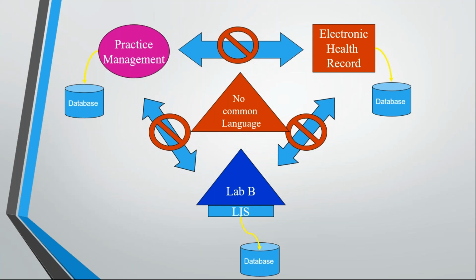Now they will have to go ahead and learn the language of each of them. And that is again a huge process that they have to go through. So they have come up with the thought of having a common language so that every one of them will learn that common language. And once they learn that common language, it is easy for each one of them to communicate with each other.